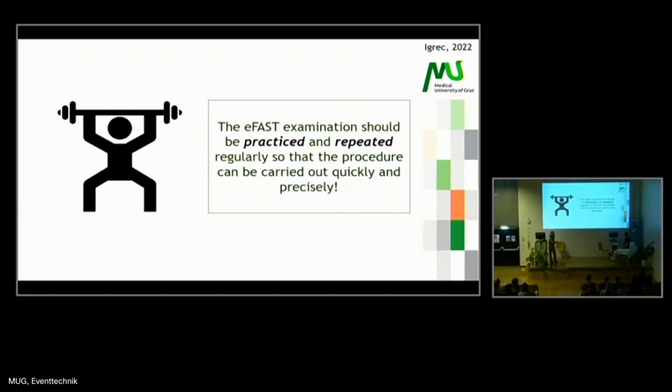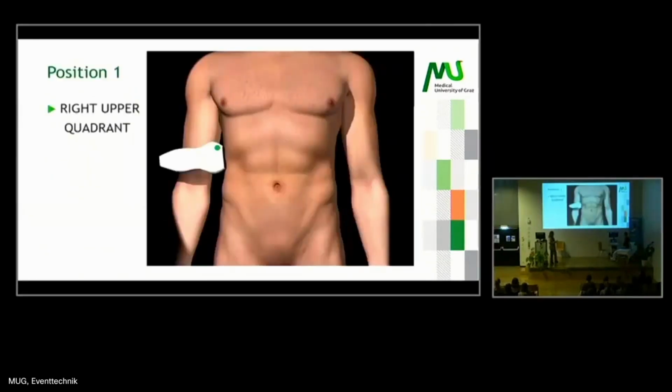It is really important to say that you need to practice and repeat this examination. It is like riding a bicycle. So you need to perform it often enough to be able to do it quickly. It should be shorter than 2 minutes.